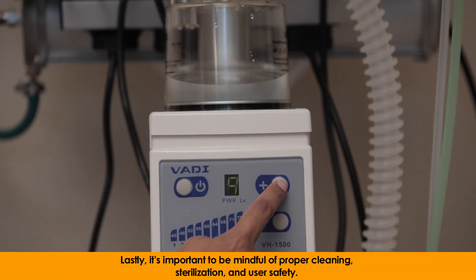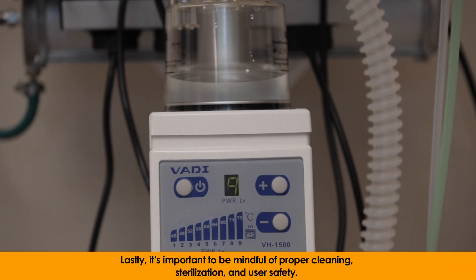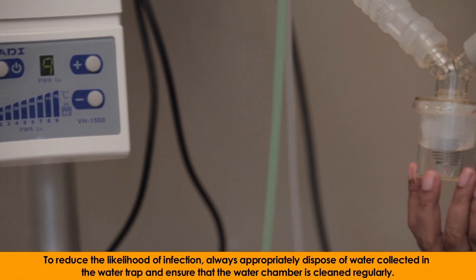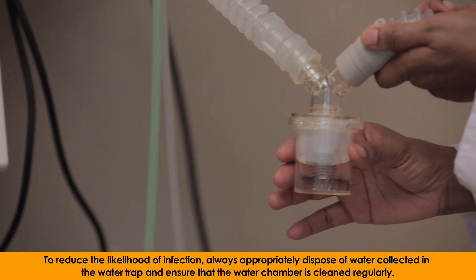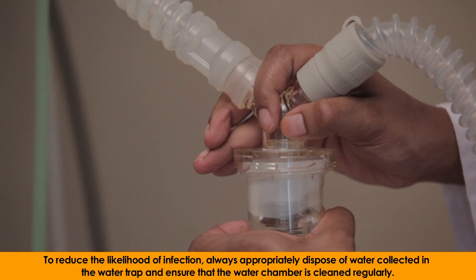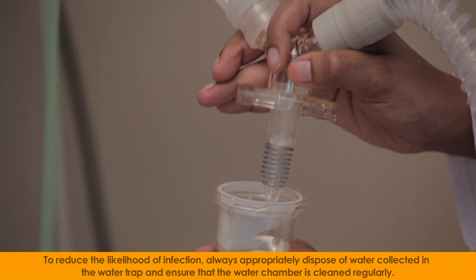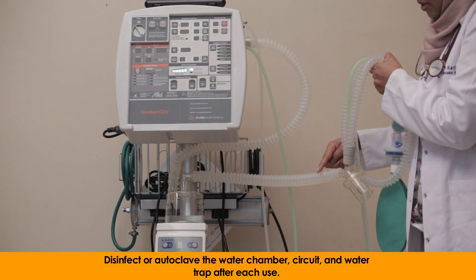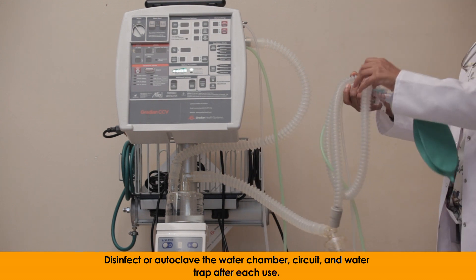Lastly, it is important to be mindful of proper cleaning, sterilization, and user safety. To reduce the likelihood of infection, always appropriately dispose of water collected in the water trap and ensure that the water chamber is cleaned regularly. Disinfect or autoclave the water chamber, circuit, and water trap after each use.